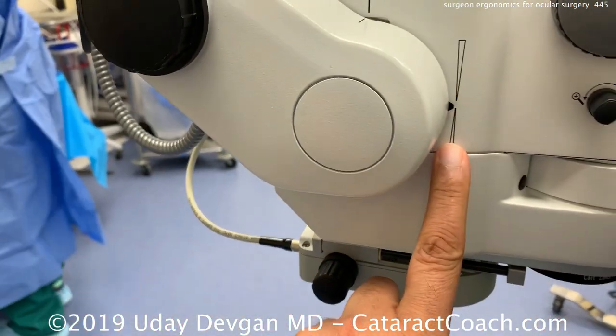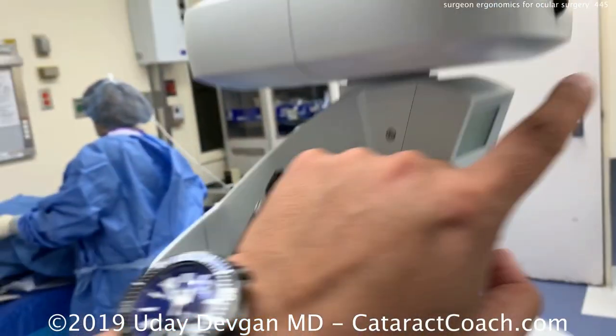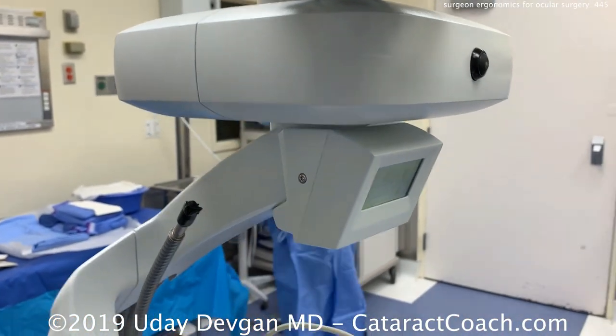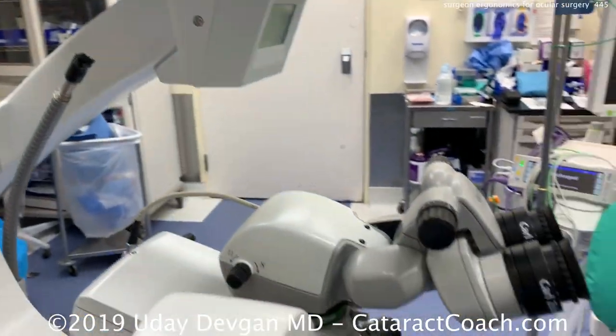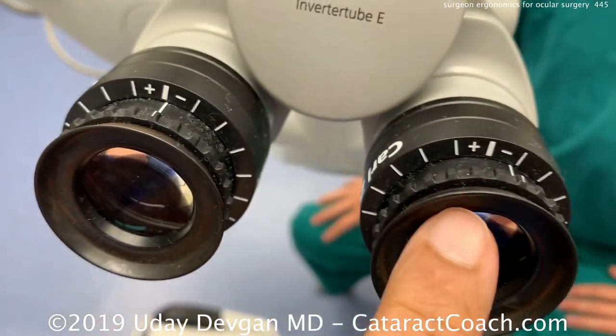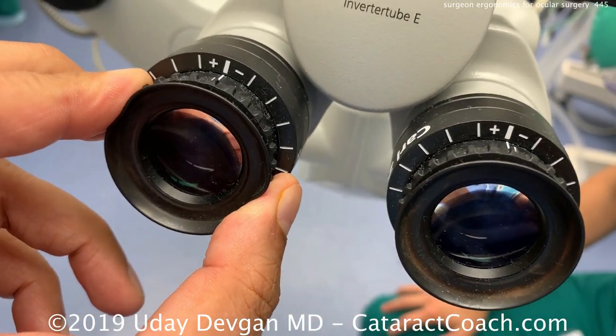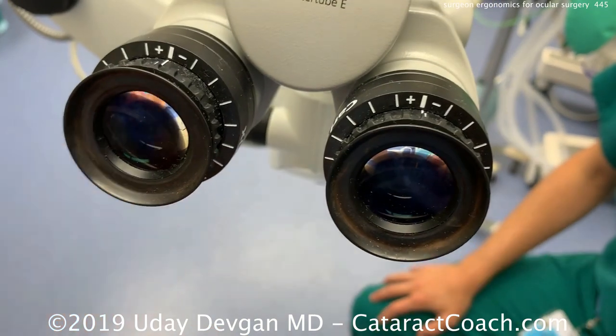When the scope is straight up and down and perpendicular, you're going to have a better red reflex — a reflection of the light back — showing that the focus is in the center. There's a button at the top to reset, which resets the X, Y, and Z as well as the zoom. You want to reset that at the beginning of your case.